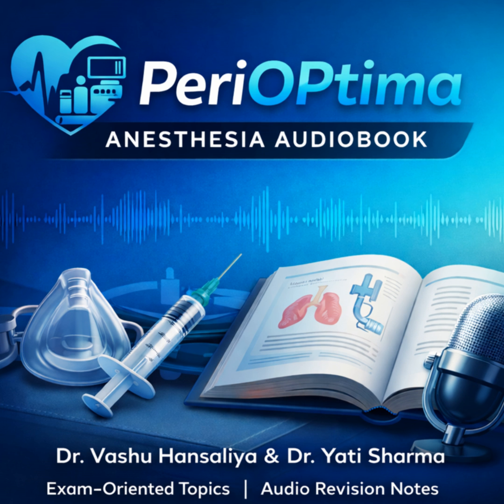That is a huge problem. Electrocautery creates electrical noise. The IABP machine might mistake that noise for an R wave. So it could trigger at the wrong time. It could trigger inflation during systole, what looks like an R on T phenomenon on the ECG. This is incredibly dangerous because it inflates the balloon while the heart is trying to squeeze against it. It's like putting a brick wall in front of the ventricle.